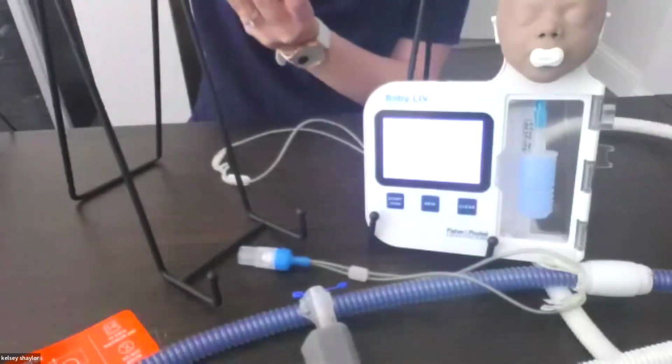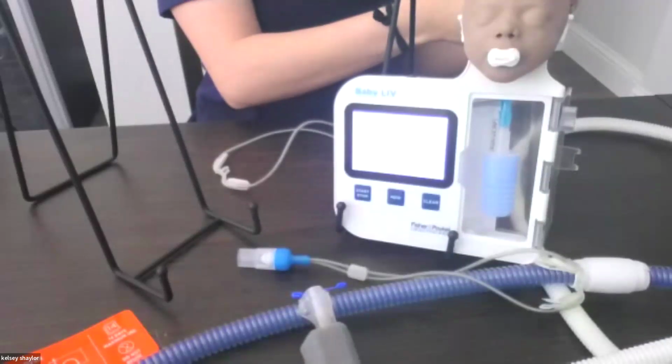And of course, that's great, Kelsey. Thank you so much. And that again, embarrassing for me, is something that I just hadn't stopped to think about until I saw the Baby Liv for the first time. Babies breathe out through the CPAP circuit. We know that. That's how we control their end expiratory pressure. But babies do not breathe out through the high flow circuit. They have to breathe out around the high flow circuit. Correct. How's that iPad doing, Kelsey?